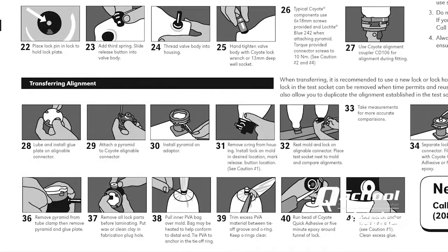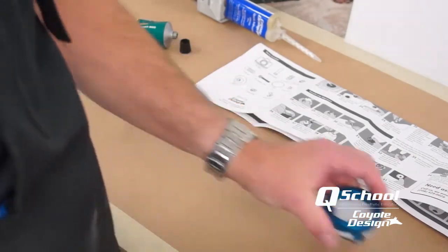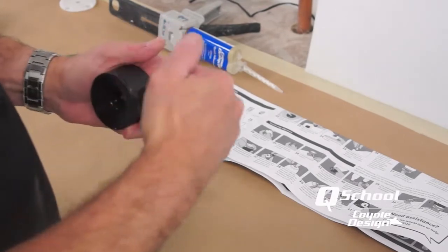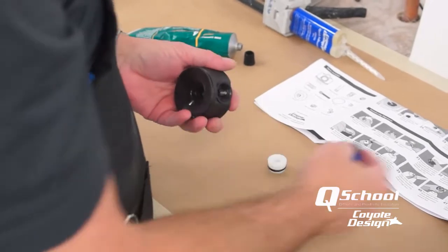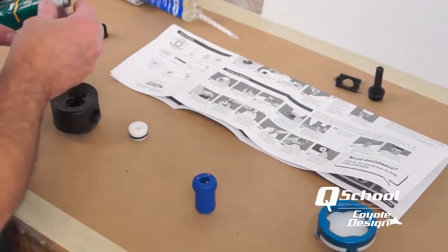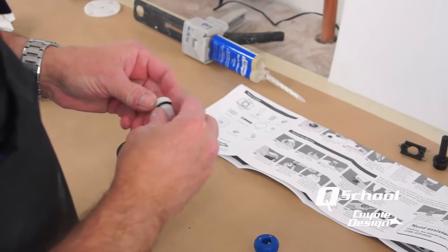The instructions show taking everything away from your transfer jig and placing it back on top of your cast with a PVA bag. One step I'm going to do a little differently: while getting my parts prepped, instead of leaving my lock together with a button and everything inside it, it actually goes onto the anchor easier if your components are removed from the lock. So I like taking out my lock plate and all the mechanism right now.